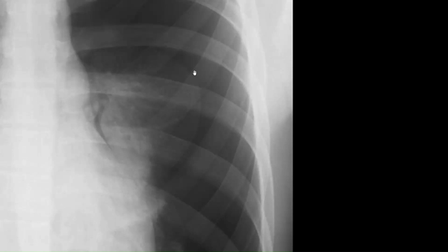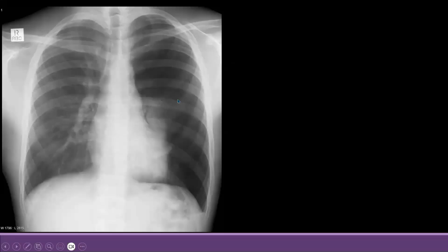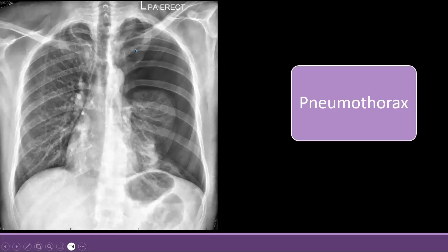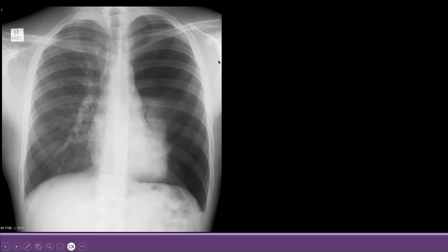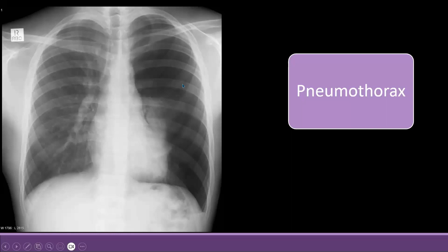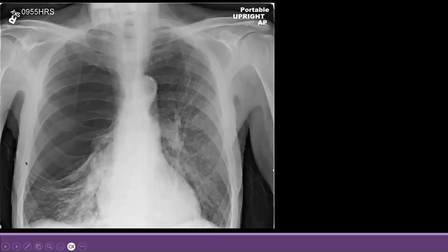In these X-rays there is no mediastinal shift, but sometimes mediastinal shift can be present — that is an urgent emergency requiring very quick intervention, otherwise the patient can develop hypotension and cardiac output can be compromised. When the patient has clinical signs of hypotension along with pneumothorax, it is called tension pneumothorax.